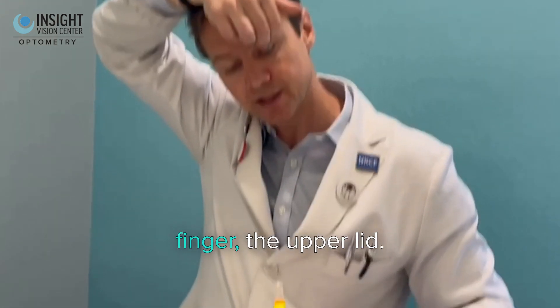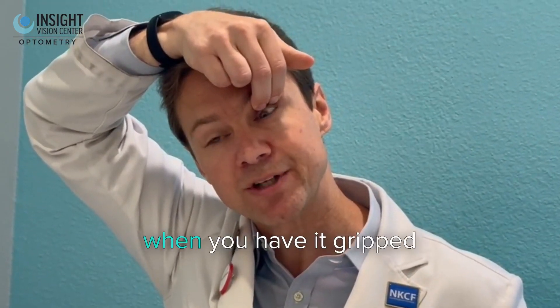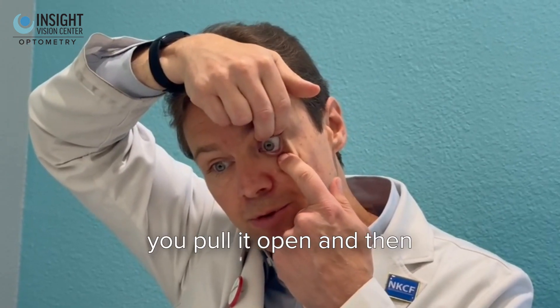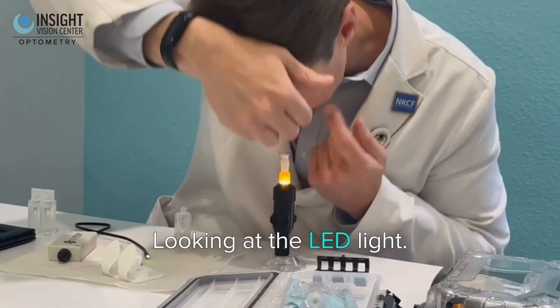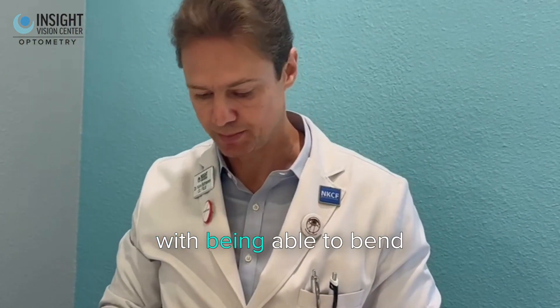You grip with your pointer and middle finger on the upper lid, because it's almost impossible to close the eye when you have it gripped like that. Then with the other hand you pull it open, and you can walk your eye right onto it, looking at the LED light.